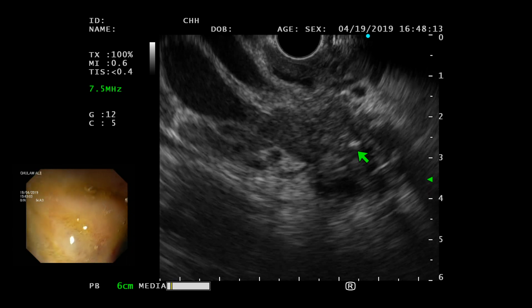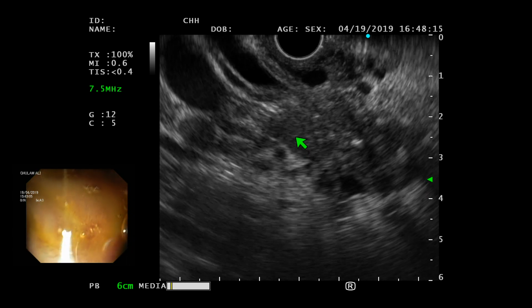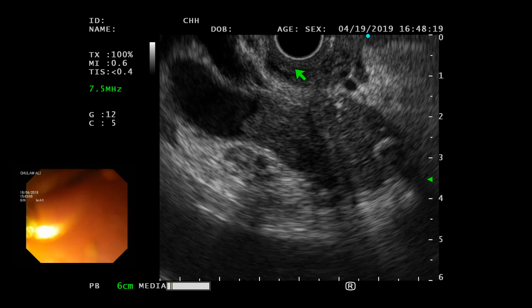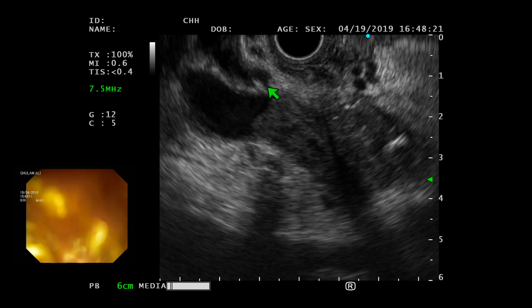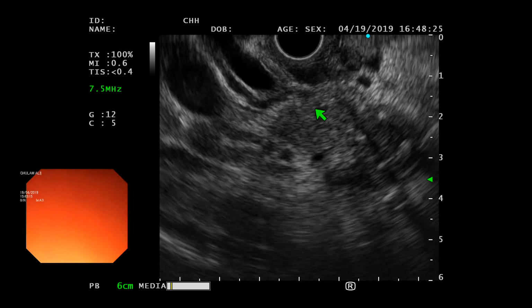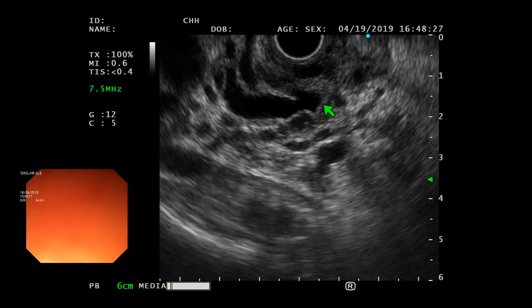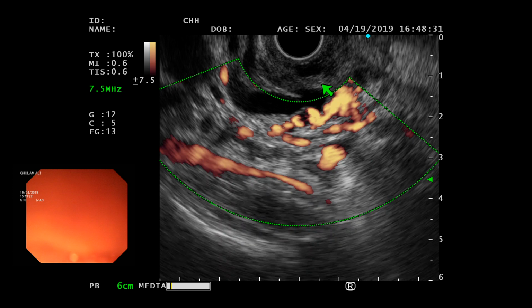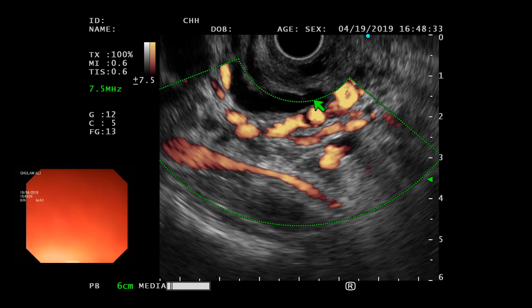Yeah, you look at that portal vein and look at those collaterals. तो ये bile duct है, ठीक है ना ऊपर. You can follow the bile duct towards the head area. चल ठीक है, चलते जाएं, follow करें, and hold on right there. So yeah, this is the bile duct, and that was actually a cystic duct.